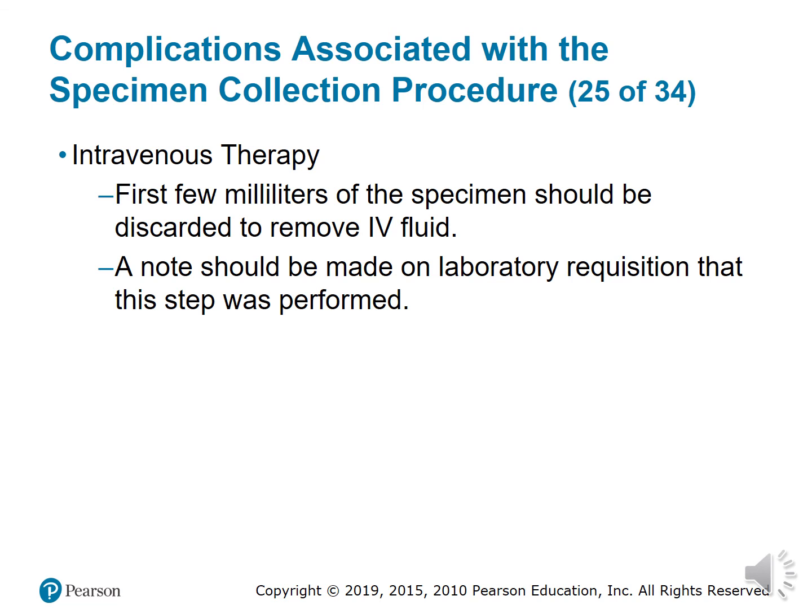Intravenous therapy. Patients who have an intravenous therapy for a long period of time run the risk of having veins that are damaged or sclerosed or blocked. It is important to remember to never collect a blood sample from the side with the IV in it. The sample can be diluted with IV fluids and will make the test results abnormal.